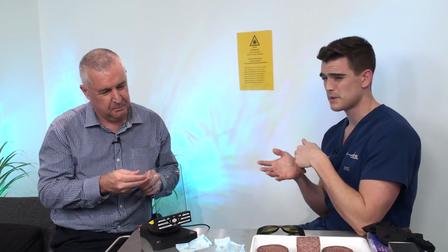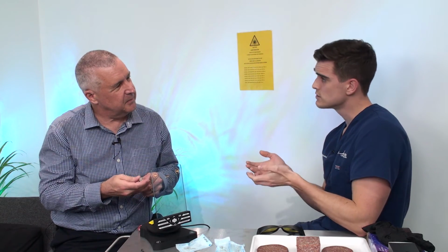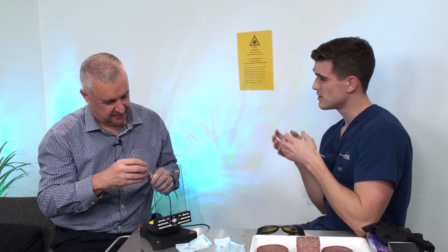You're going to be driving the laser a little bit for us. So I thought, as a young laser user, it'd be interesting for you just to tell us for a minute or two, while I'm setting it up, the major ways that you would be using the laser in your practice at the moment. Well, at the moment, basically, I've been using it for about 6 to 12 months, and I've limited it basically to using it for maybe some gingival troughing in those patients where you find that there's hemorrhage or you're finding it difficult to achieve hemostasis, maybe in replacement of using cords, for example, like you were discussing before. So I found it really helpful in those really difficult situations where you know the tissues are really inflamed and engorged.